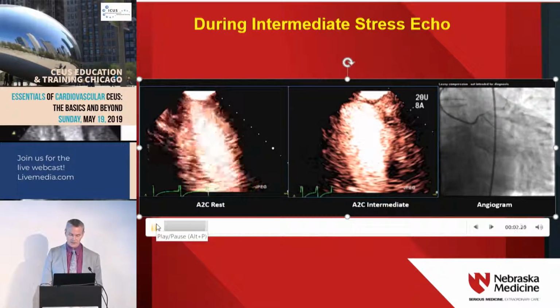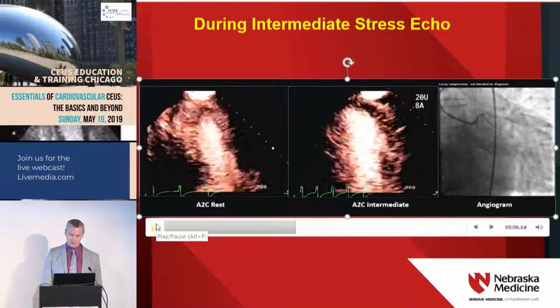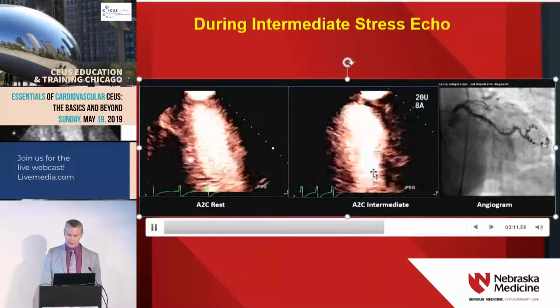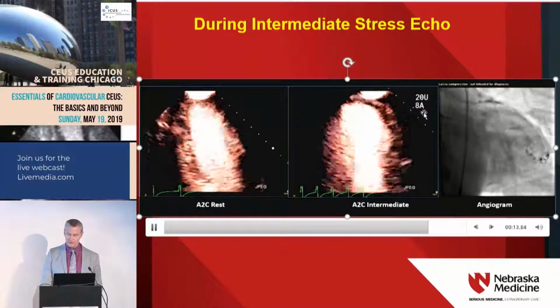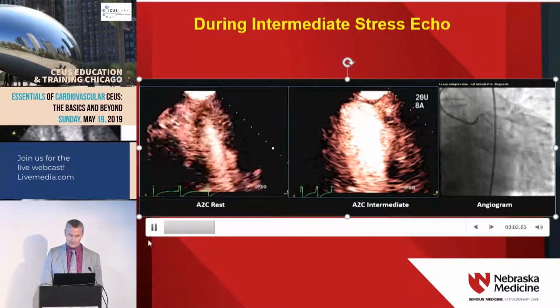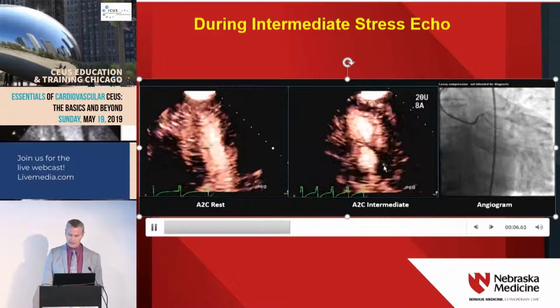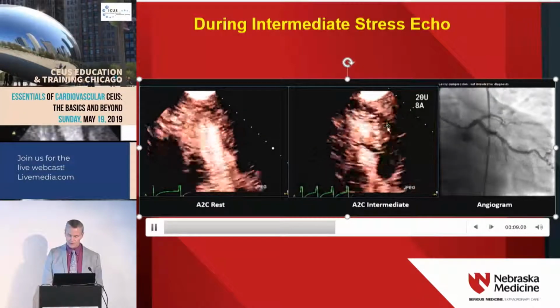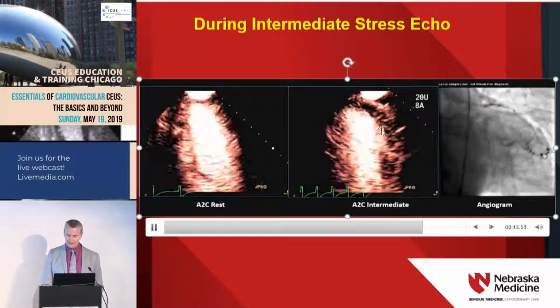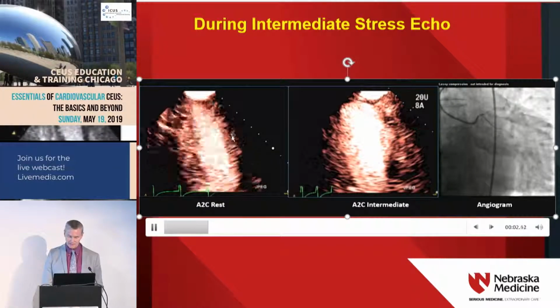There's resting apical 2 chamber. Again, this is about 2 seconds after the high MI impulse. And here it was just during a 20 mic infusion. We had already given 0.8 of atropine, but there was really not much heart rate response yet. And look at that whole anterior wall. Even though wall thickening still looks pretty good, following the high mechanical index impulse, virtually no replenishment. Well, we had pretty good replenishment under resting conditions.